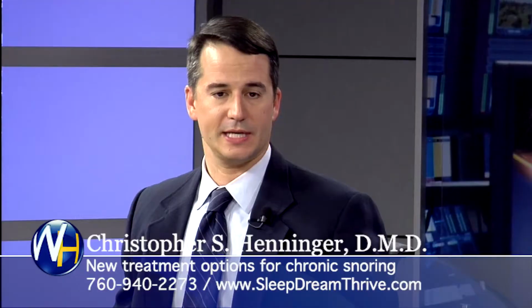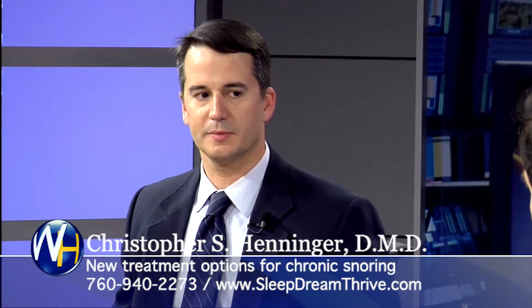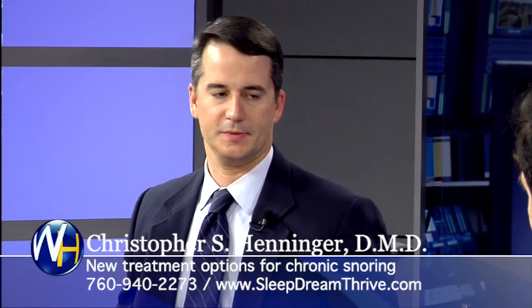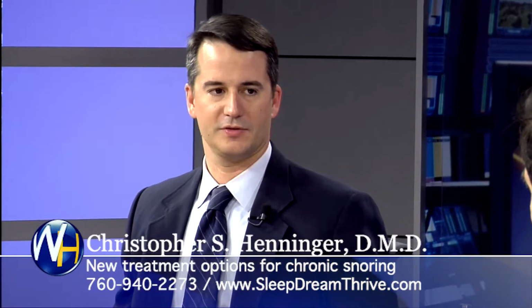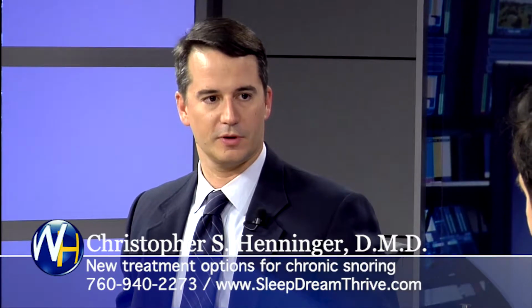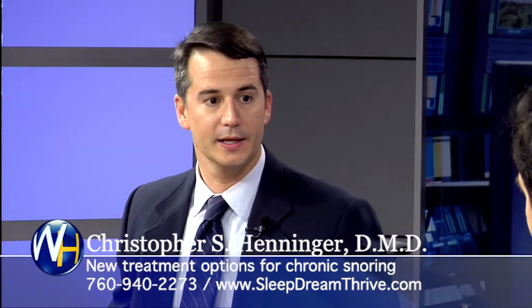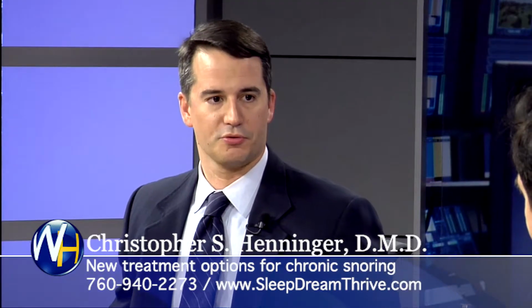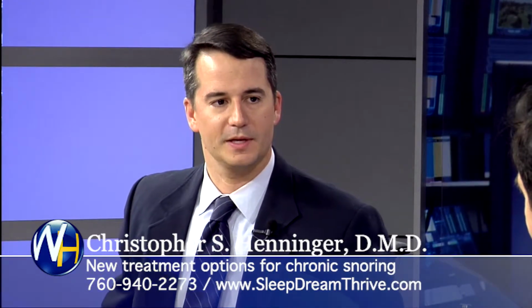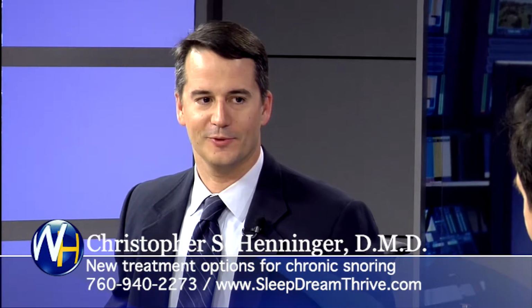It is, and we have to sort of titrate the position of your lower jaw to make sure we're in the optimum position. So there's a little bit of science that goes behind this. We don't just throw it in your mouth. We have an initial setting that we start people at, and then we advance them forward to see if they get better and better. Eventually we'll sleep test you again to make sure that we can prove that your sleep apnea is gone. But you're going to feel better way before we test you.